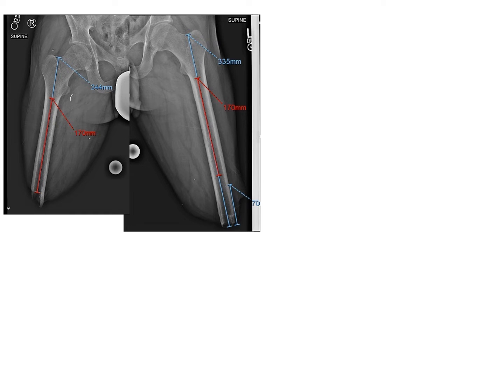This is an example of what the x-rays look like. You can see one side was a little bit shorter than the other, and the plan was to make the sizes equal — and the planning that goes into that.